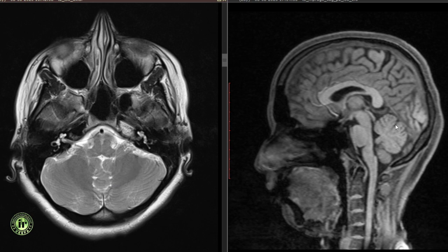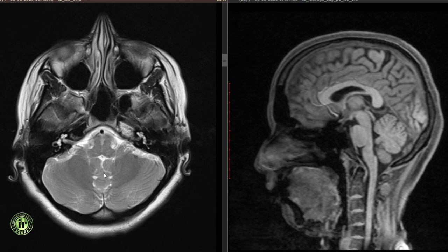The deep transverse fissure divides the cerebellar hemispheres and vermis into three lobes, each made up of multiple lobules. The primary fissure separates the anterior lobe from the posterior lobe, and the posterolateral sulcus separates the flocculonodular lobe from the posterior lobe. The nodule is the only lobule of the flocculonodular lobe and can be identified posterior to the fourth ventricle. The flocculus is largely separate from the rest of the cerebellum and can be seen extending laterally inferior to the vestibulocochlear nerve.